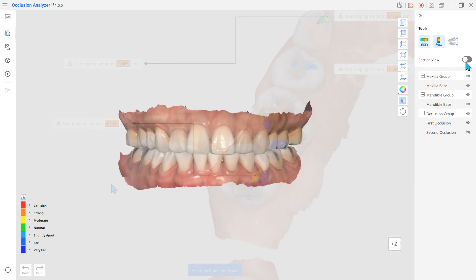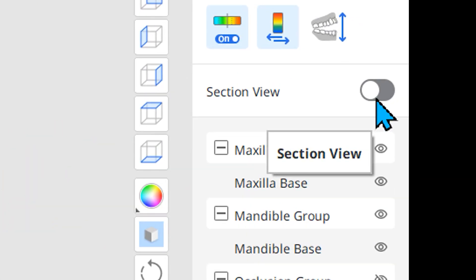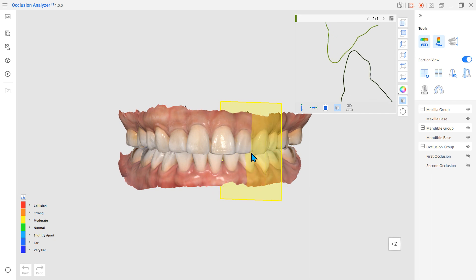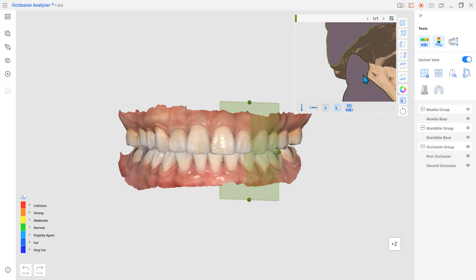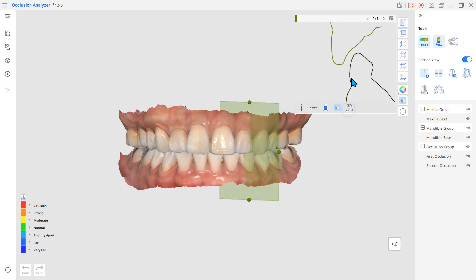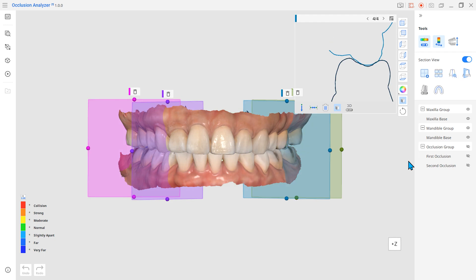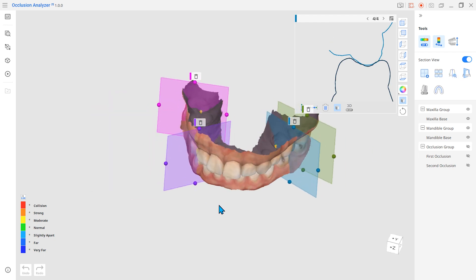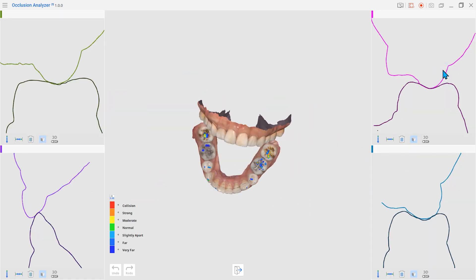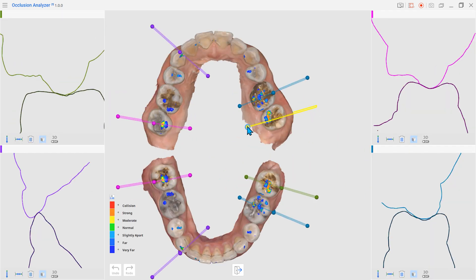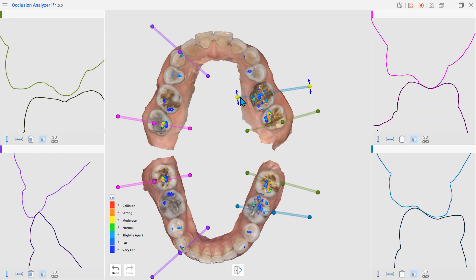The app also has a Section View tool. With it, you can check the cross-section of the desired points and then measure distances in the section view. You can even compare multiple section views all on one screen.